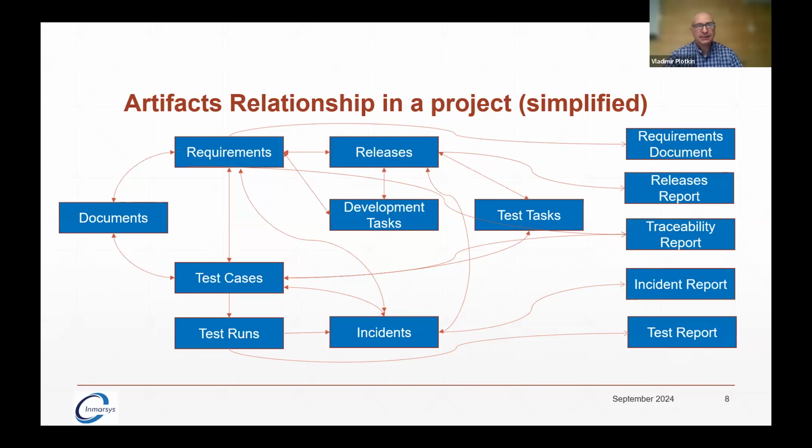Because if you start putting conditions like, if you press this button the blue light shall come on, but only if today is Thursday, but if it's Friday, it shall be yellow light, but on every third Thursday, it needs to be actually green. Something like that. It's very difficult to test.